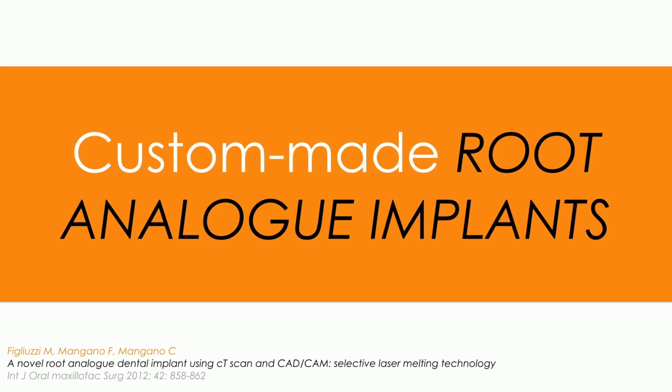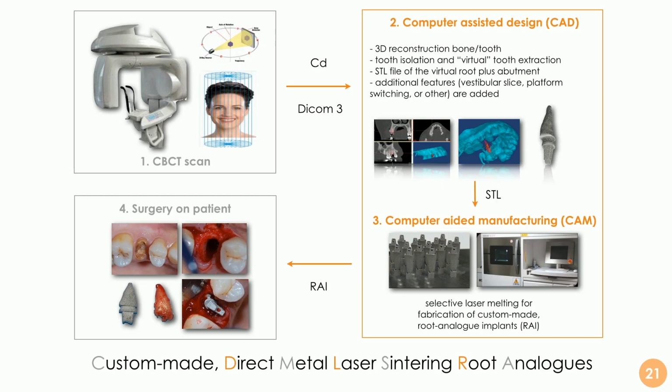Root analog implants are one example of this application. We performed these cases with Professor Figliuzzi long ago, and I have to admit that in my publication portfolio, this publication is one of the most cited of all, because probably it's a little bit creative, and being creative is always appreciated by our colleagues. So the design of the study is very simple.